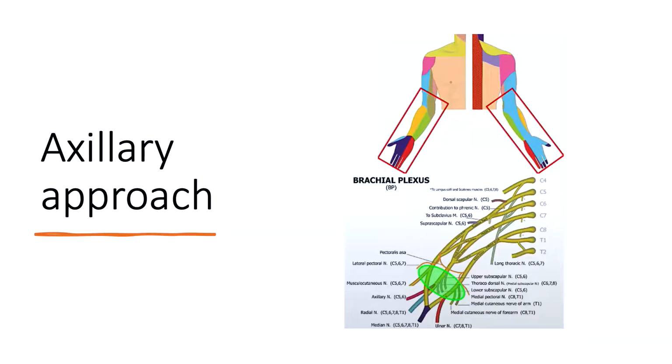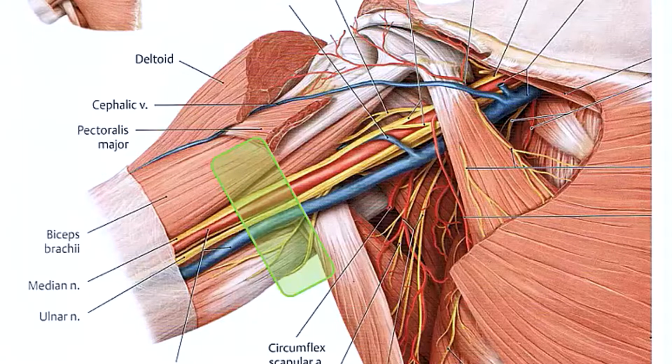In the axillary, I think it's easier demonstrated, as we have had a few in the last few days with some of you. It's just fun to direct the needle to different nerves. Keep in mind that for close to 30 years, I used to tell people, always when you do an axillary block, block the musculocutaneous nerve, because you don't want the patient to keep the ability to flex the elbow during surgery.